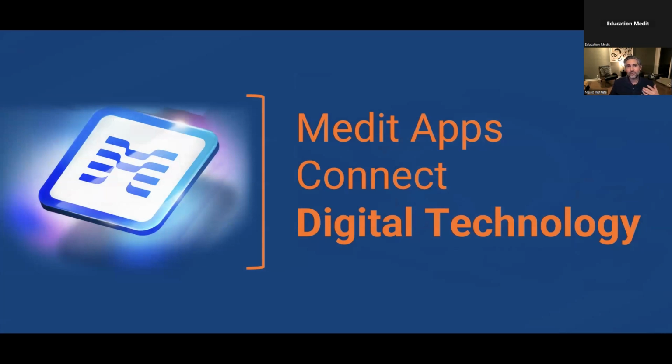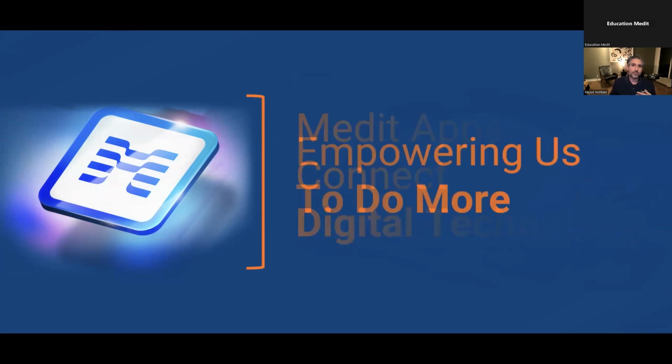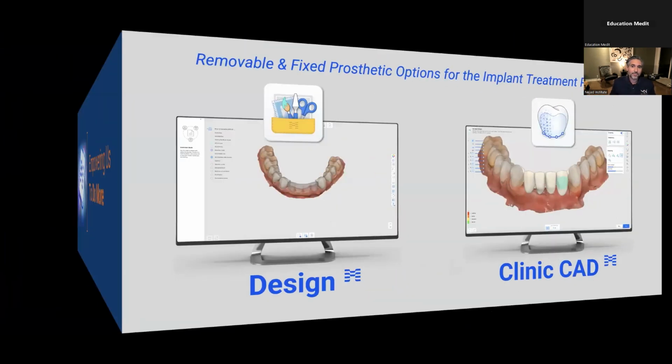3D printing was something cool in concept, but the technology now is here where we're able to do things, produce utility, and Medit has empowered us to do those things. And that's why I love Medit and I'm such a big fan, because they are unleashing the possibilities for dentistry to improve, for things to get easier and better for all of us and for patients to benefit from that. So that's really huge.